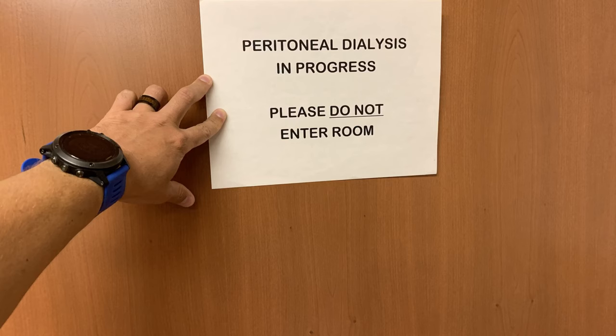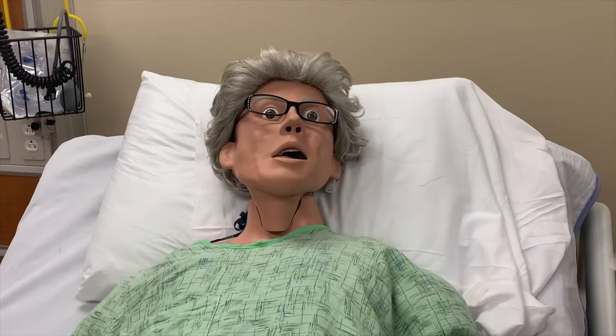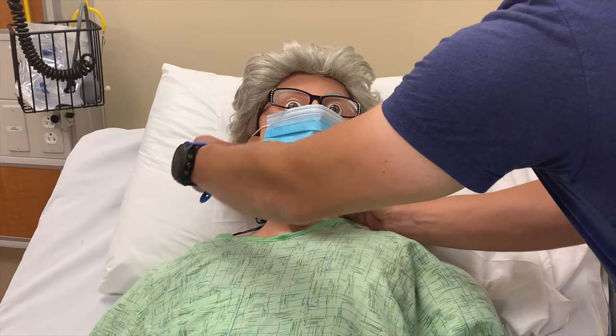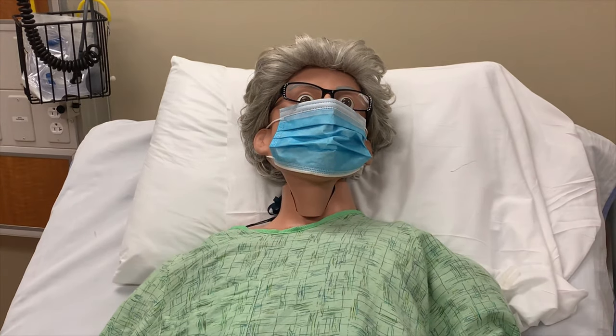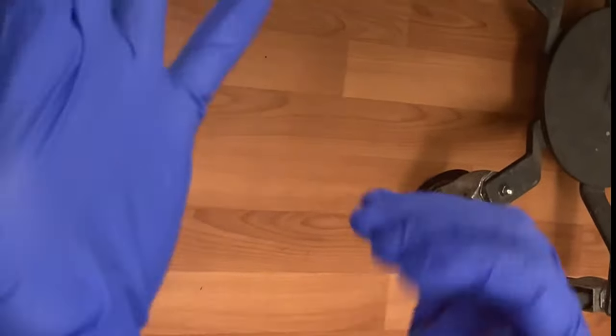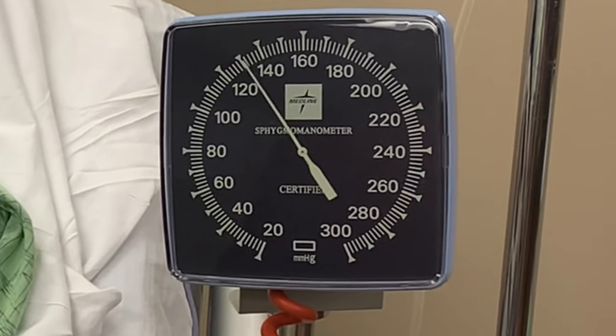If everything passes inspection, it's time to begin. Place a peritoneal dialysis in progress sign on the door. Ensure everyone remaining in the room is wearing a mask. We'll be opening the peritoneal space up to air, so we need to minimize airflow as well as the potential for introduction of foreign bacteria into the peritoneal space. Put on your clean gloves, and check your patient's vitals.